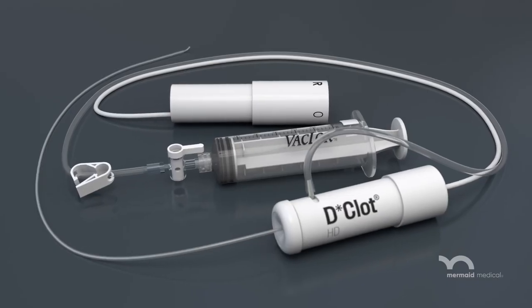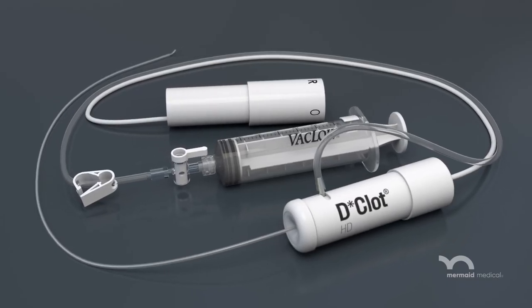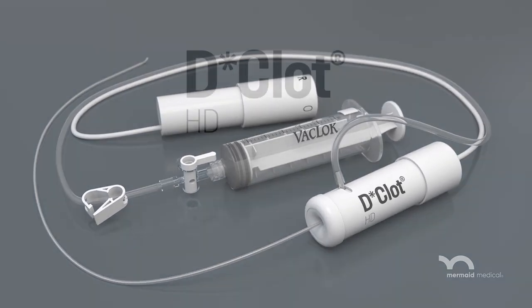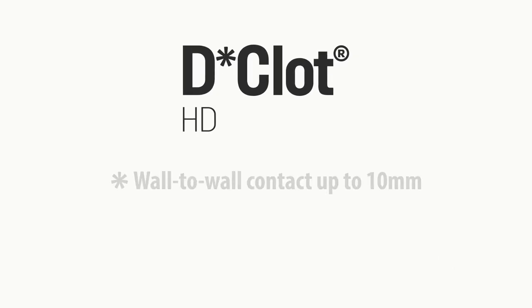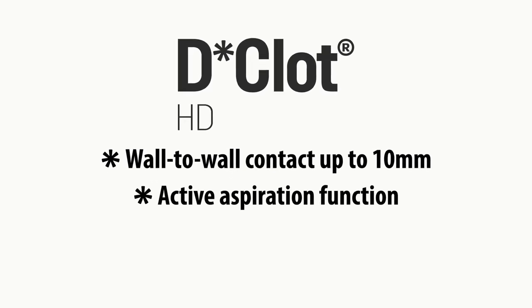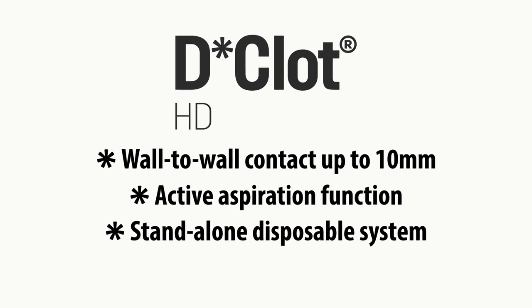The Mermaid Medical Declot HD system is an effective treatment option for removing thrombus in dialysis fistuli and graft. Declot HD: wall-to-wall contact up to 10 mm, active aspiration, and a stand-alone disposable system.